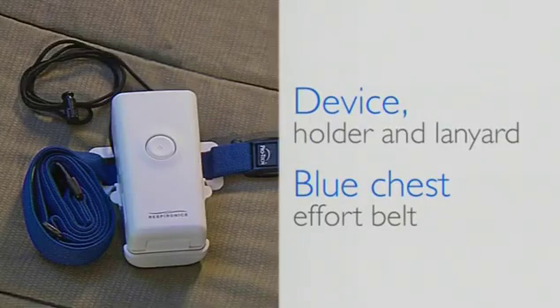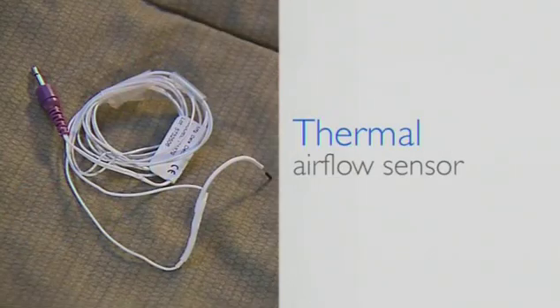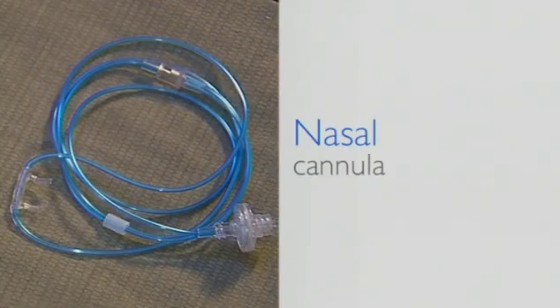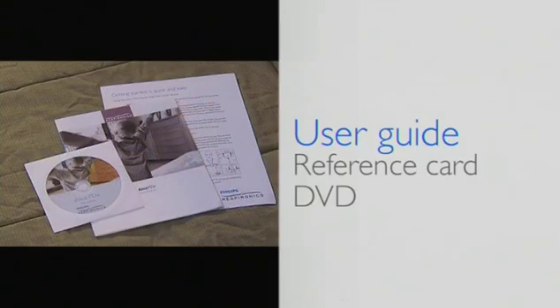Depending on how your provider configured the system, the components may include the Alice PDX device holder and lanyard, which may have the blue chest effort belt attached, the abdominal belt and wire set, a thermal airflow sensor which monitors airflow from your nose or mouth, and a nasal cannula which also evaluates breathing and determines if you snore.